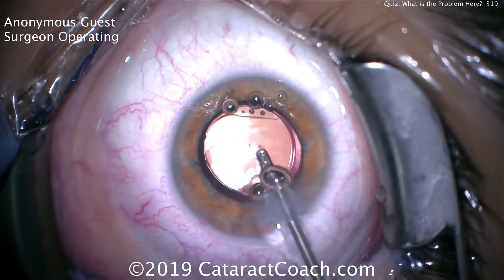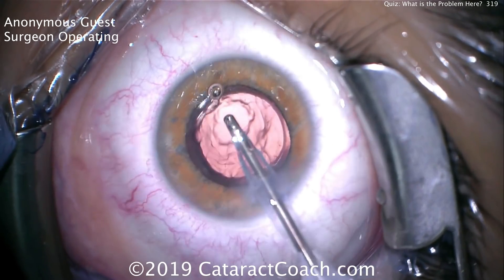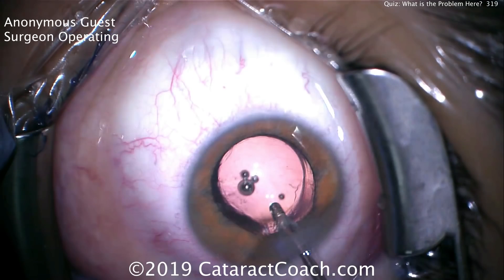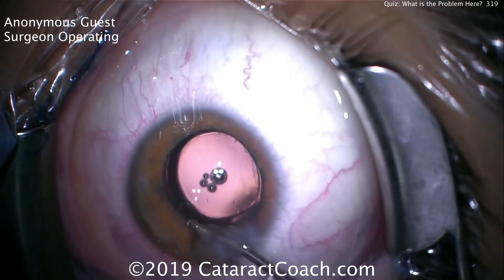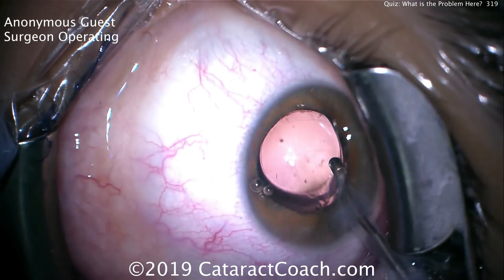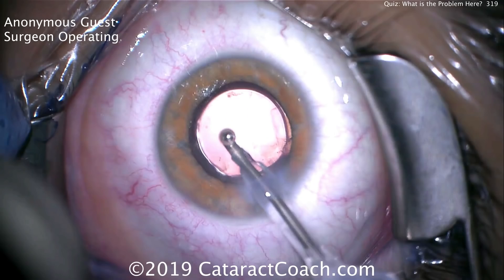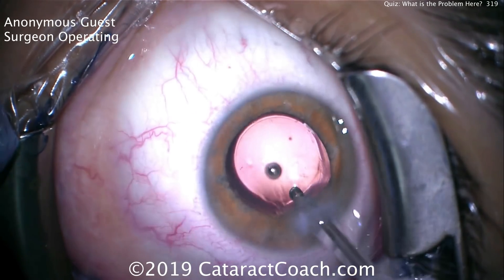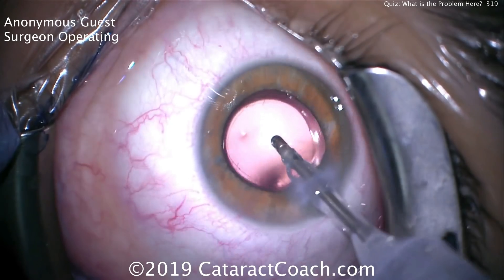The surgeon is thinking about what to do, but viscoelastic is being aspirated out of the eye with the IA probe. At this point, perhaps the surgeon either didn't notice, or has simply decided to leave it in the eye upside down. If you do leave it upside down, this lens is fortunately a planar design so there's no vaulting. If the lens does have a vault, putting it upside down shifts the effective lens position. Also consider lens geometry: a bi-convex lens may have less of an issue upside down, but a plano-convex, meniscus, or other form could have a big change in the dioptric effect in the eye. It seems the surgeon is going to leave it in the eye upside down.